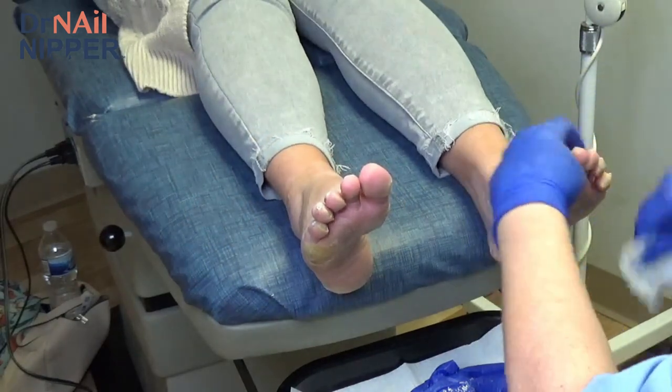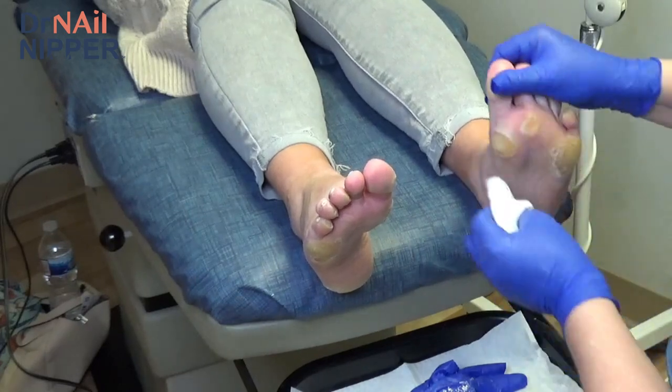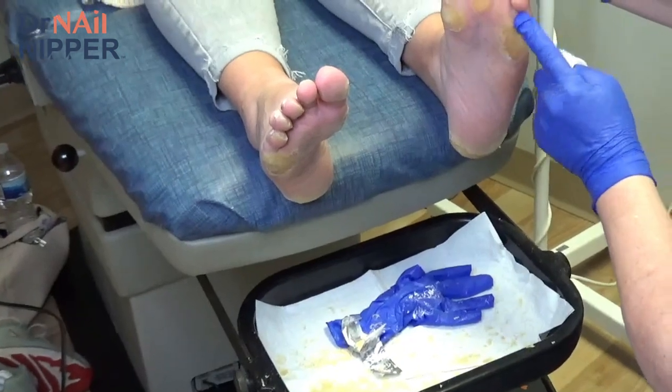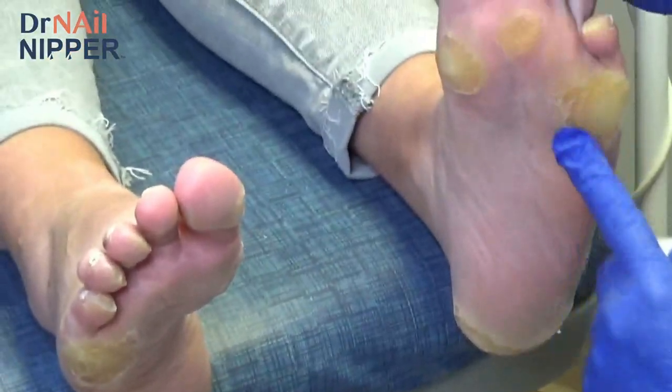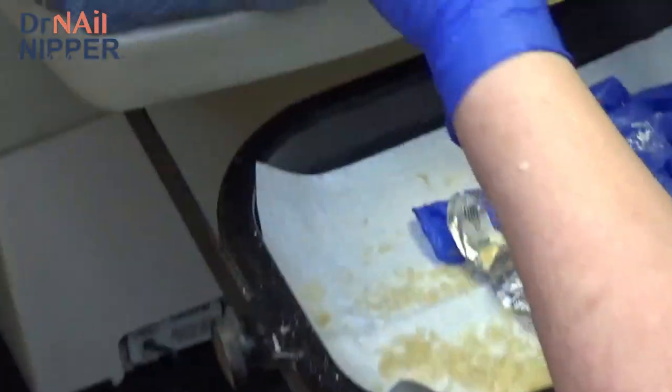Okay. So one thing that I just want to point out to people watching this is, yes, you're going to say, oh, you could have gotten so much more. But underneath this yellow callus skin, there's good skin, and you can only go so far before it bleeds. So we're doing it to your comfort level.